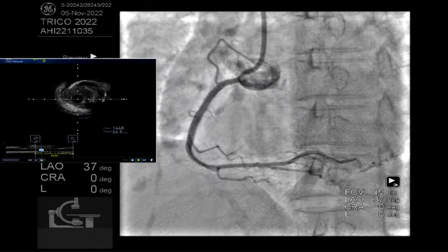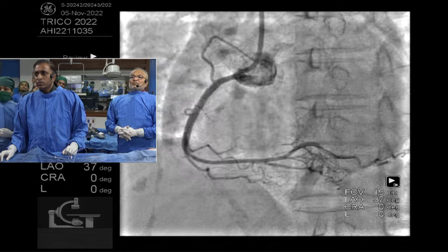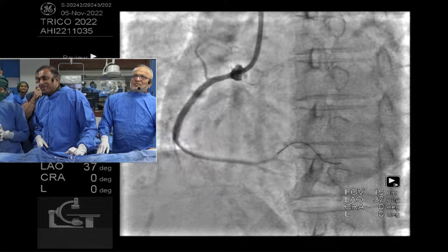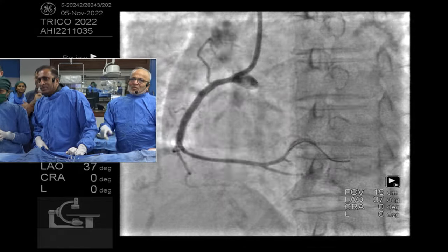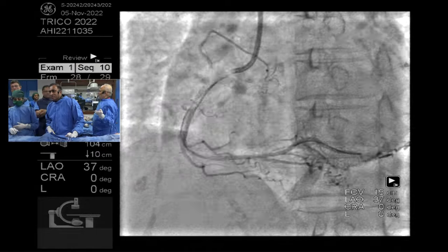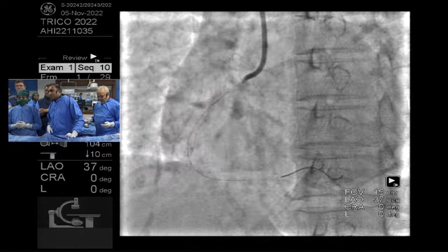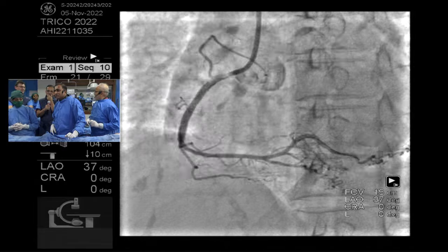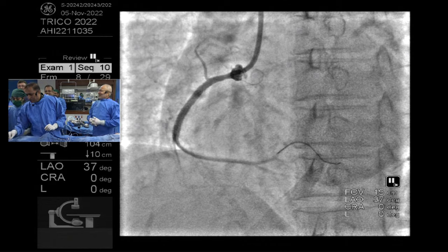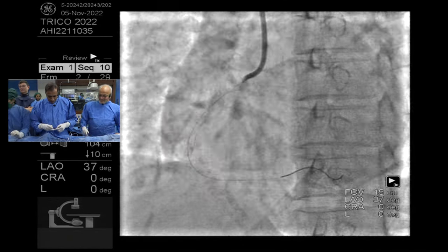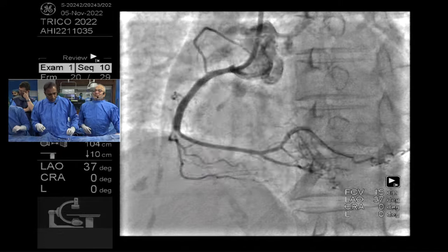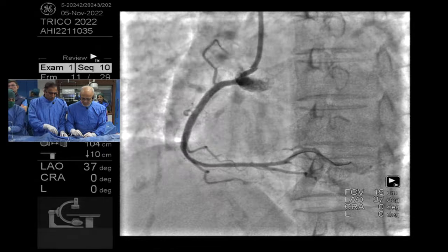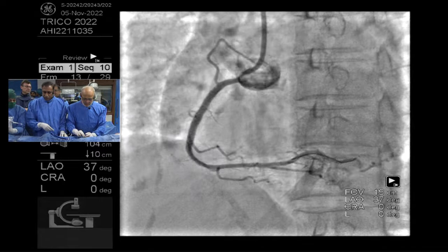One thing I want you to see on the screen — the air kerma is 72 right now. That is less than one-fifth of an average diagnostic case in my lab, where we are very radiation-conscious. I don't use Cine — all of this is fluoro-save, except for very few images. Even if my fellow keeps the foot on fluoro or Cine for too long, I intervene. When we did the randomized REVIEAR trial, the reviewers had a big problem with our low values — we had to explain to the journal that these are the traditional exposure levels in this lab. Radiation dose hygiene is the biggest component, and that is amazingly low here.